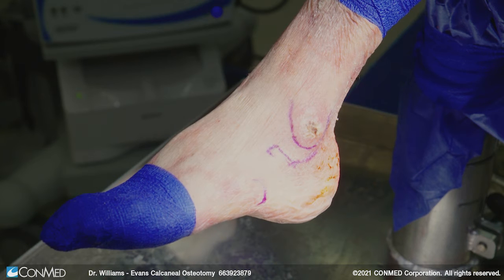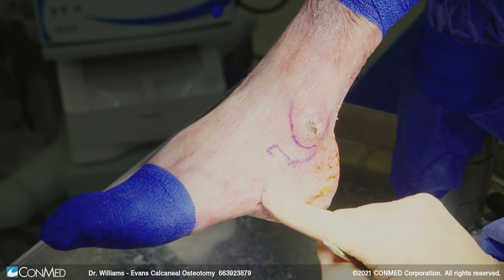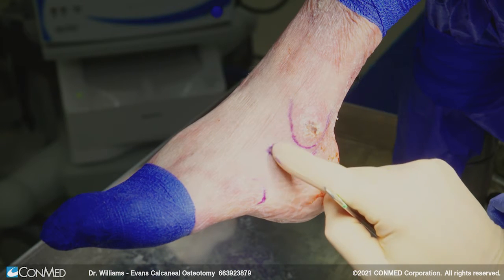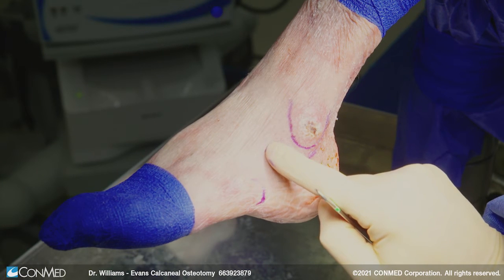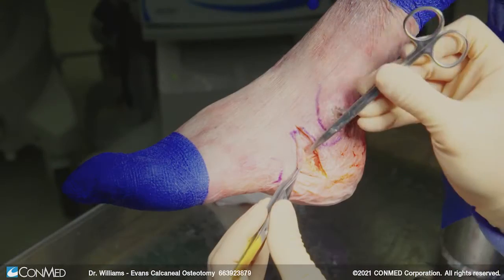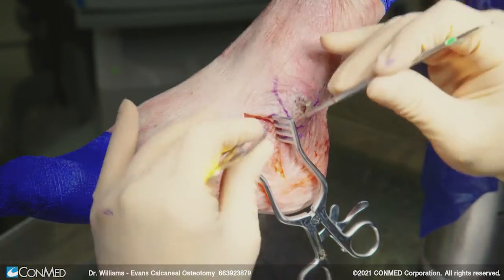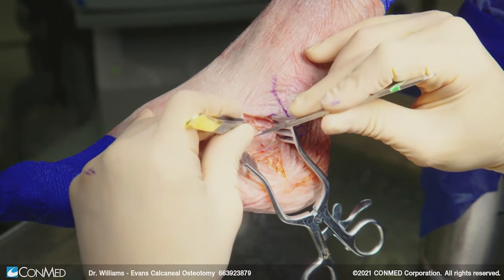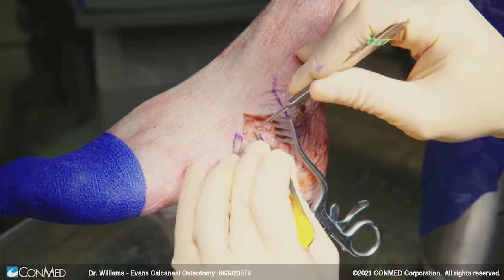We're going to use an MTF Evans Allograft. Landmarks: lateral malleolus, fifth metatarsal, and then we're going to see this little declination angle right here in the calcaneus. There's your anterior process of your calcaneus. I tend to make just an oblique incision. Right here is the lateral dorsal cutaneous nerve, and right at the tip of that scalpel is going to be my peroneus brevis tendon. My goal is to come up above that and reflect it all down to preserve them.